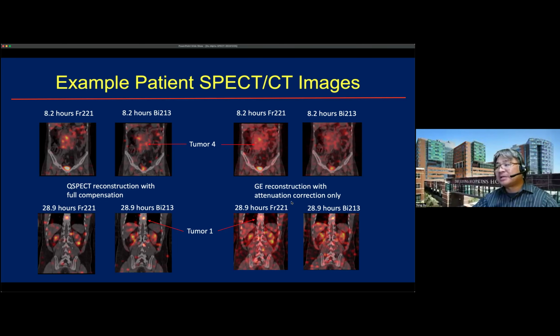We're also working closely with Dr. Lin Jianmeng from UIUC to develop a new SPECT system, especially for alpha-emitters, which we call alpha-SPECT.